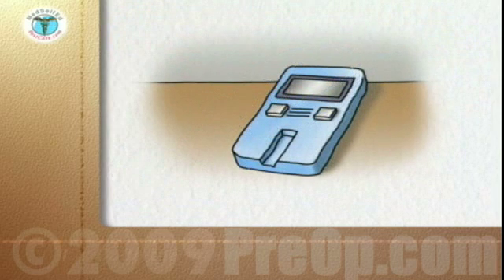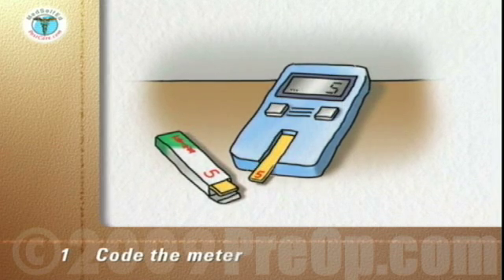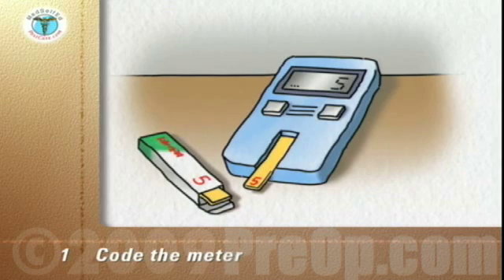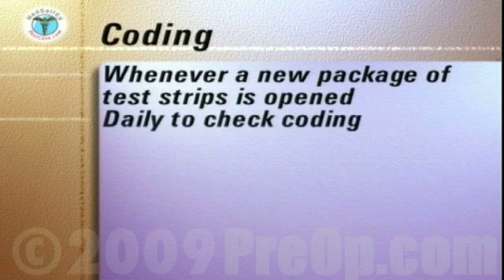The first step is to code the meter — to match or calibrate the meter to the reactivity of the test strip. This is done by following the manufacturer's instructions and matching a number on the meter's display to a number on the code strip or on the test strip package. Coding is done whenever a new package of test strips is opened and daily to ensure the meter is coded correctly.